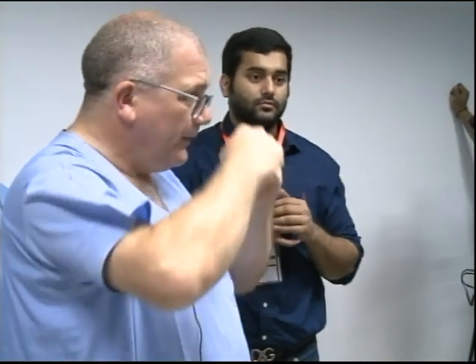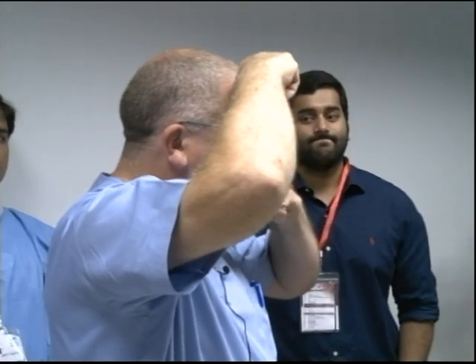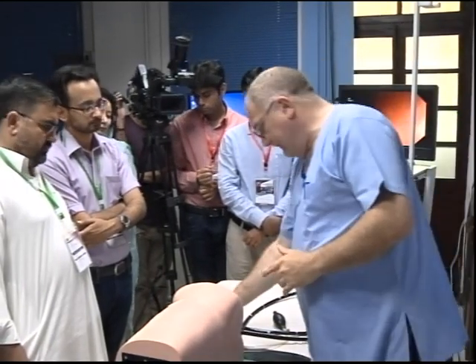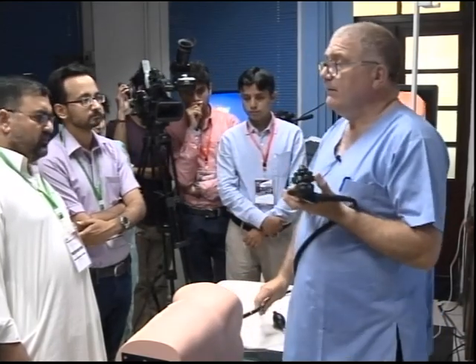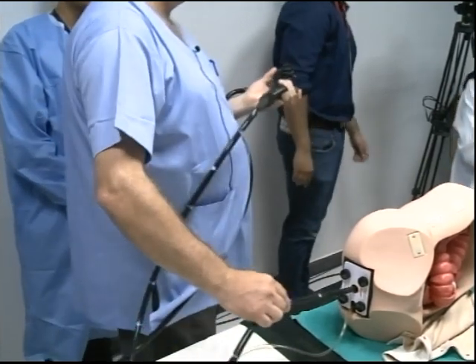Yeah? So have a think, when you go home, you'll start doing this. Get your fingers close to your face till the fingers disappear. Then you'll get a concept of what the scope will do. Goes down, up, down, through. That's where a lot of people go wrong. You see the lumen, but you can't go forward. The folds are being pushed. Yeah? So, you're a handsome man, and I can't see through you.